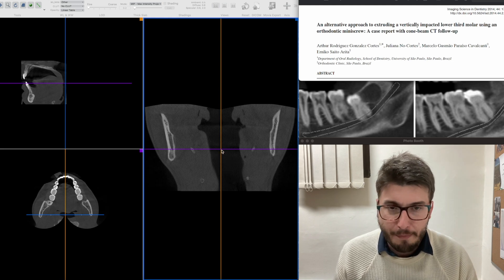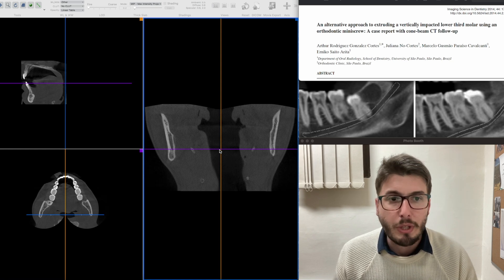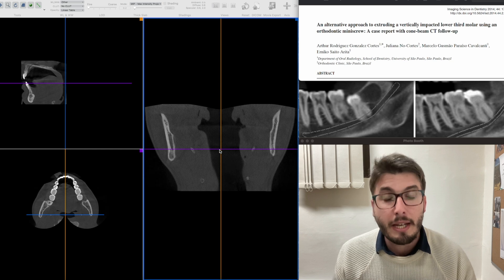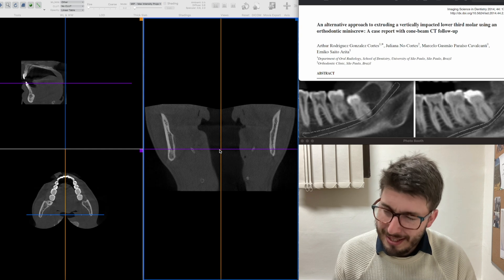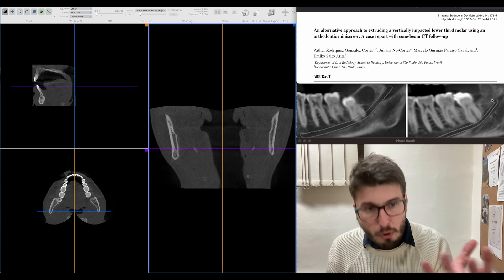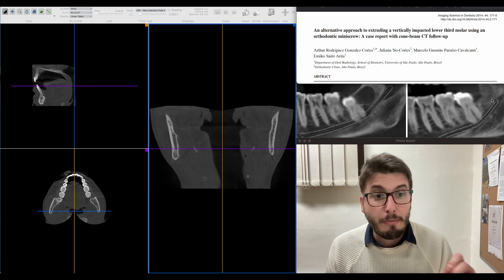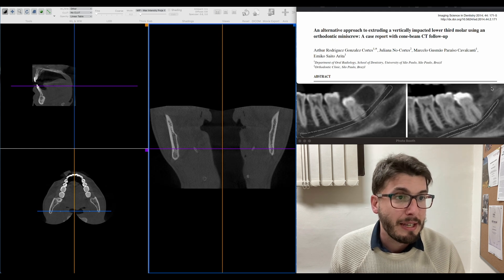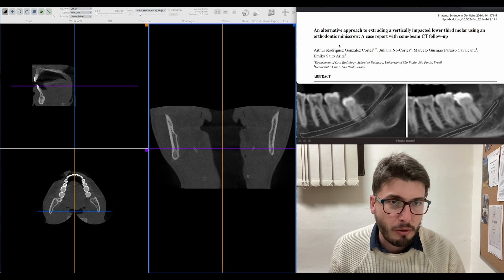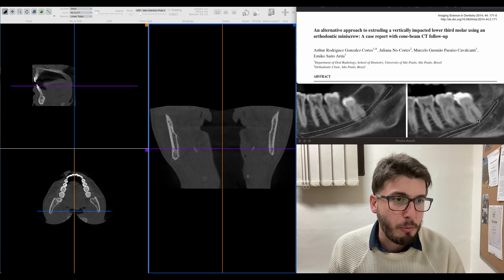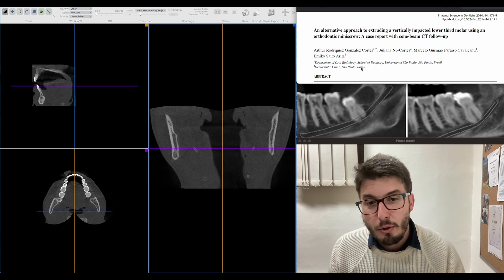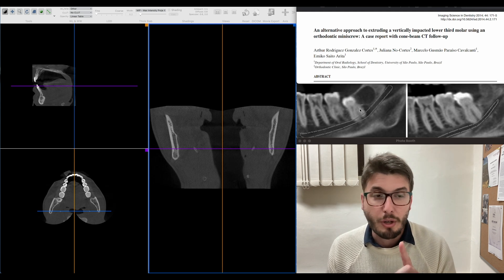You need to tilt the axis to navigate through the three orthogonal planes, making them parallel to the structures you want to assess, to obtain very nice cross-sectional images for proper diagnosis. In this article, the cyst was enucleated — removing the cyst along with its surrounding epithelial tissue. CBCT taken months later showed the area healing, and using elastic traction with an orthodontic mini-screw, the tooth was lifted to detach the roots from the mandibular canal.